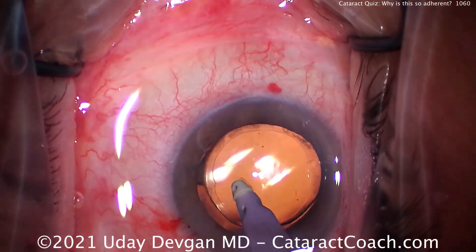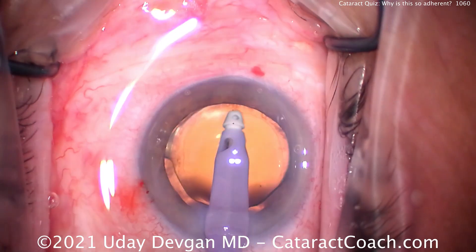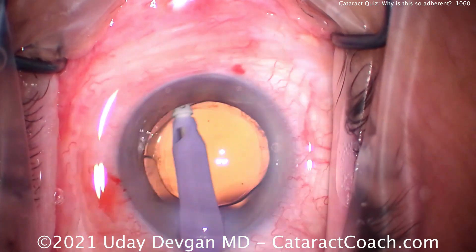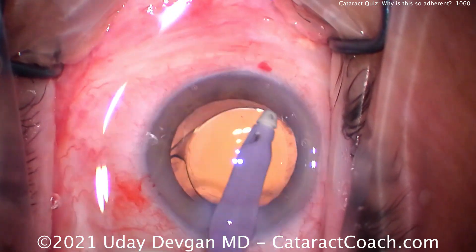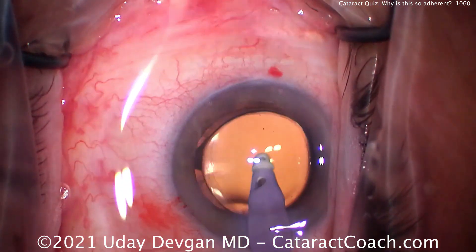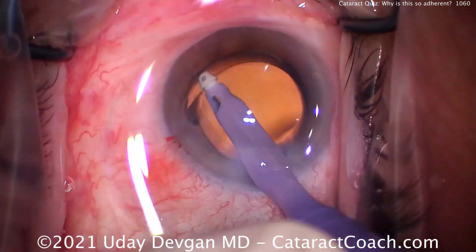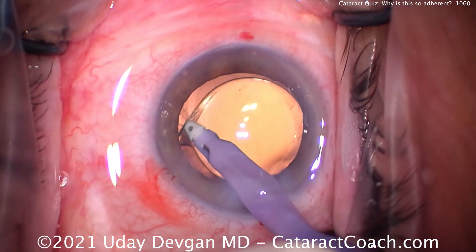Now let's polish up the capsular rim — watch carefully here as we polish up this capsular rim and tell me what you see. Nice centration. Let's clean up some of that — good, good — polishing that up, then go to the other side. That looks pretty good. Now here comes the important part — watch carefully. We go to this side and we're cleaning that up and — whoa, what is that?